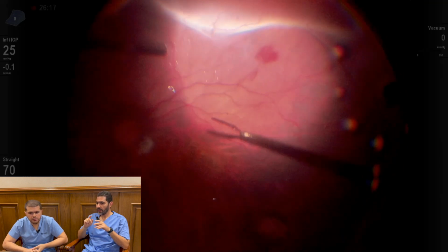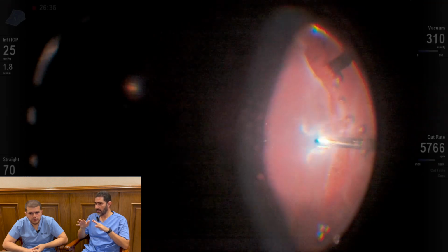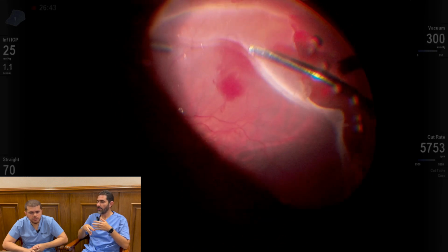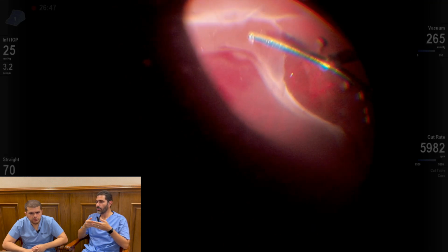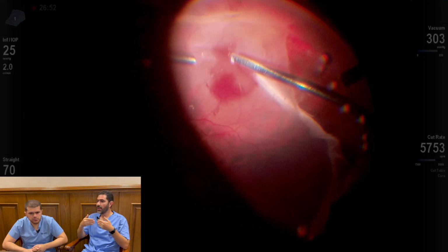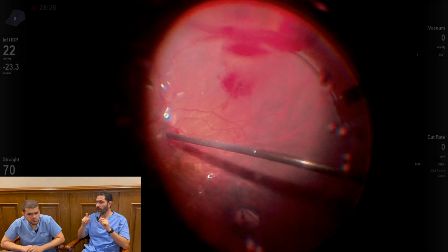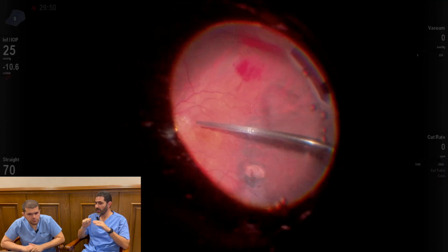And also, what is very interesting, you're showing that you are alternating between the cutter and the forceps. So this may be a very tedious procedure, that every time you take the cutter out and put the forceps in. So keep doing this, and in my opinion, this is very safe to achieve the target you are aiming for, that you remove all the vitreous. Don't add the chandelier, because even if you add it, sometimes you cannot peel all this hyaloid with the bimanual, and you just need to alternate between cutting and doing this pulling.